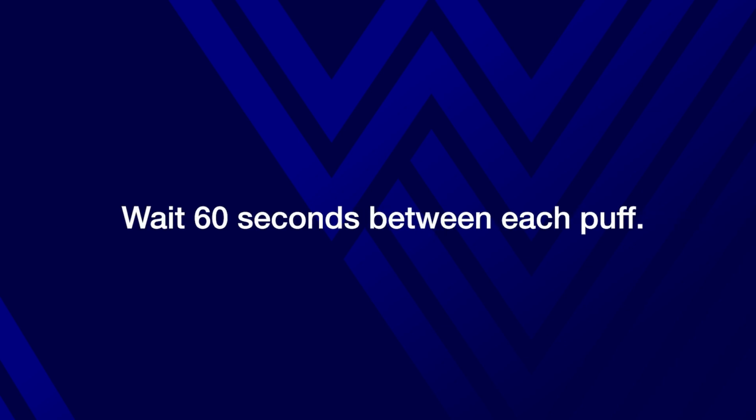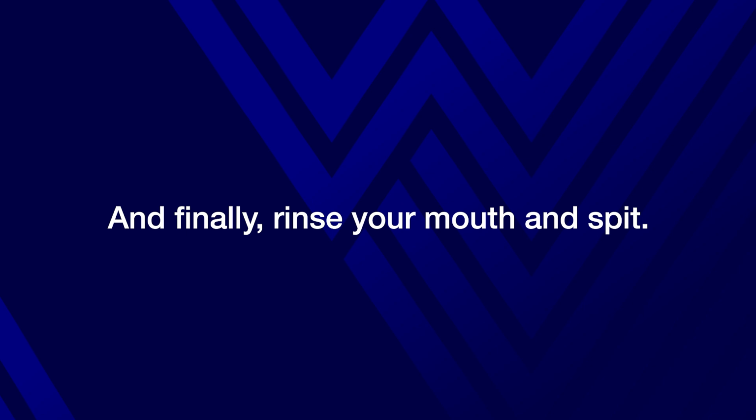Wait 60 seconds between each puff. And finally, rinse your mouth and spit.